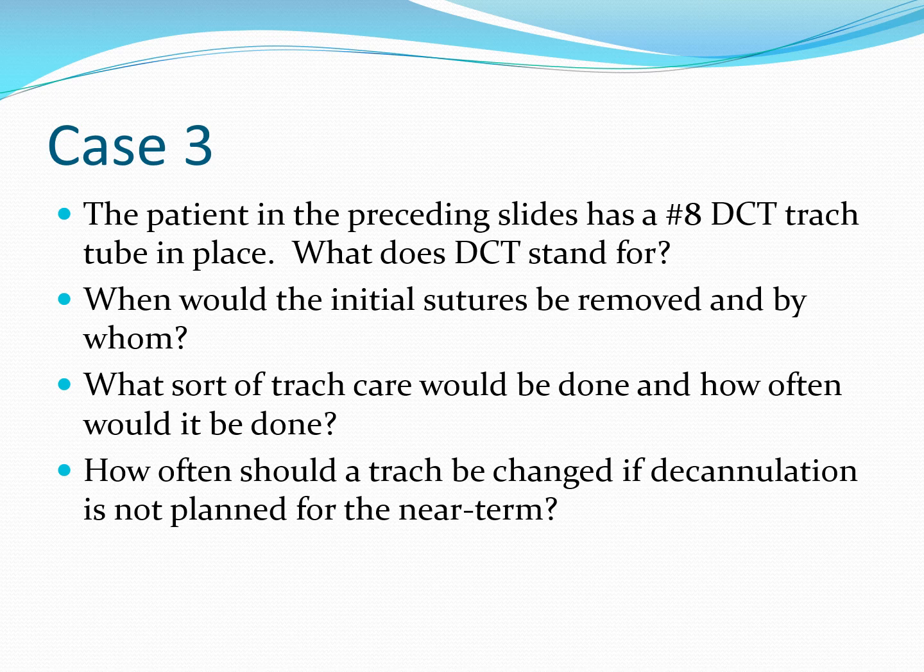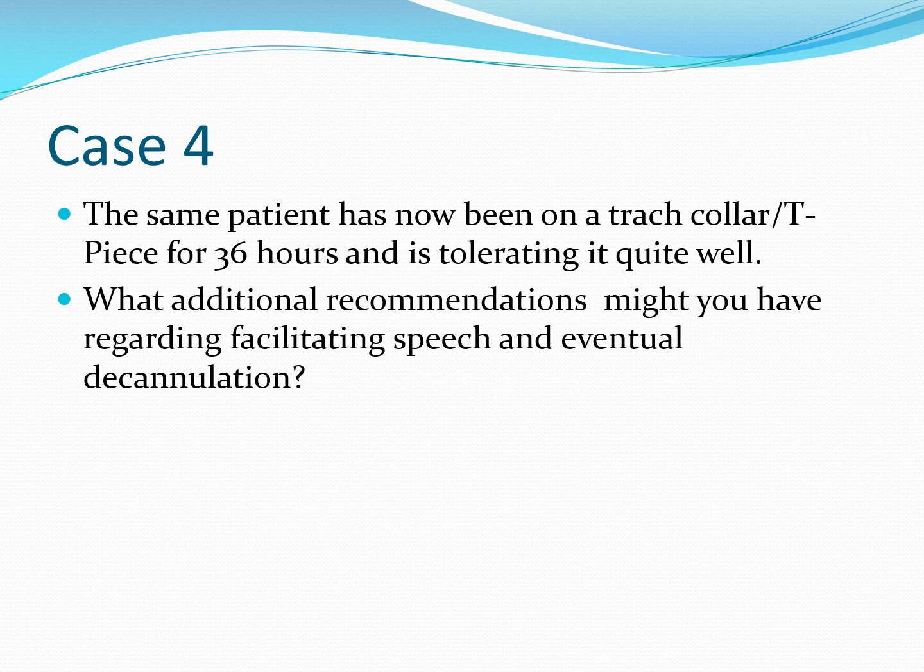If the patient's getting transferred out, and let's say it's been 3 weeks, maybe it's a good idea. They're in an acute care hospital, they're going to a long-term care facility. Good idea, maybe change it right there in the acute care hospital, so it would alter that interval when the clinical situation warrants it. Case 4, just like case 2 is a continuation of case 1, case 4 is a pseudo continuation of case 3.